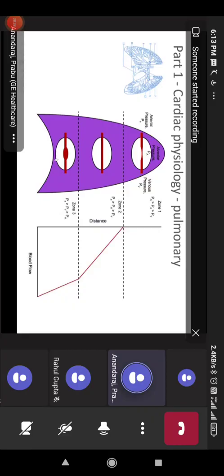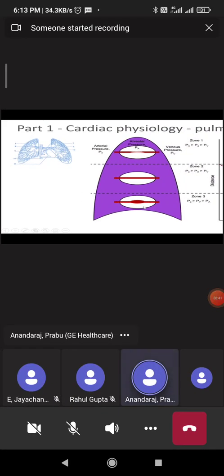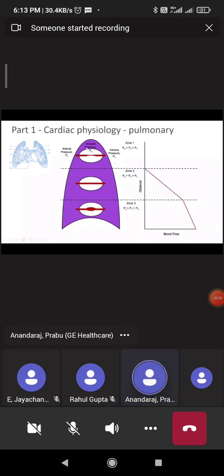The irony here is that this is having more, whereas here a lot of gas has entered. What happens because of that? The alveolar pressure will be too high. And when the alveolar pressure rises, the blood vessel will be squeezed like this, so the blood that can flow through and come out will be minimized. It is actually like we are nipping it.